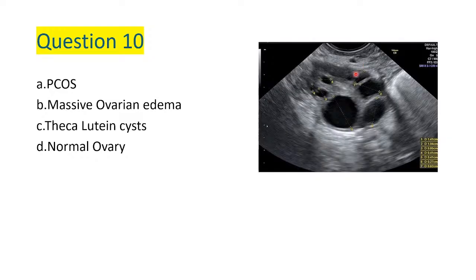So this is a normal configuration. That's a very normal ovary.